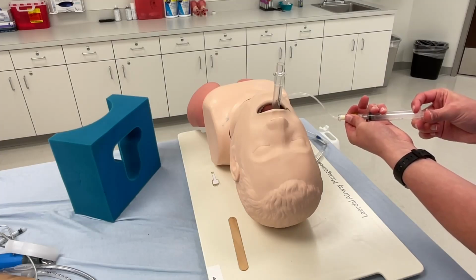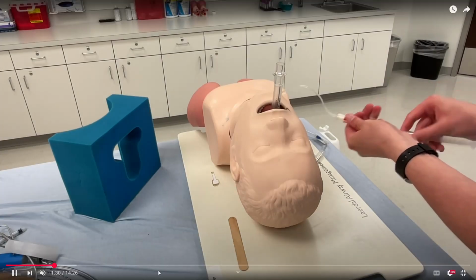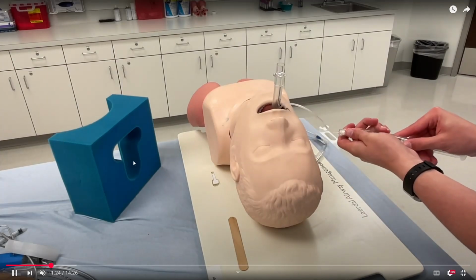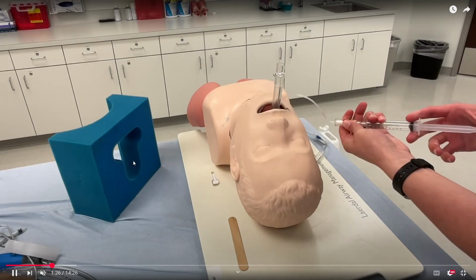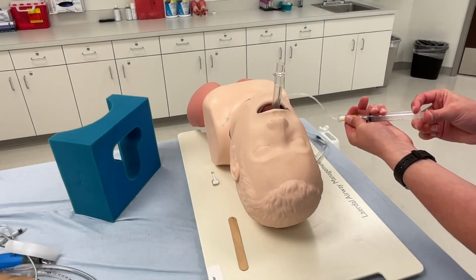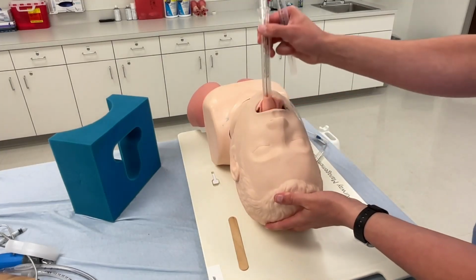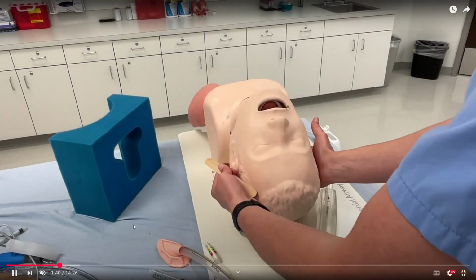And notice a slight shift in the tube. If you pay really close attention, you'll notice a slight tick. Just right there. And that means it's seated. And then you could hook this up and check it for airway patency and check for end-tidal CO2 to confirm placement. I-gel insertion, and I-gel is basically a very rigid LMA.